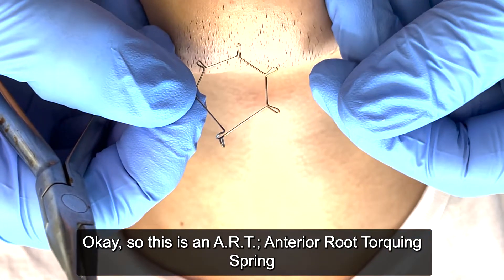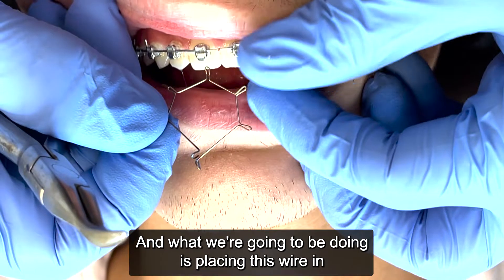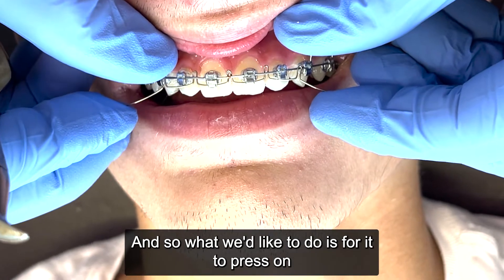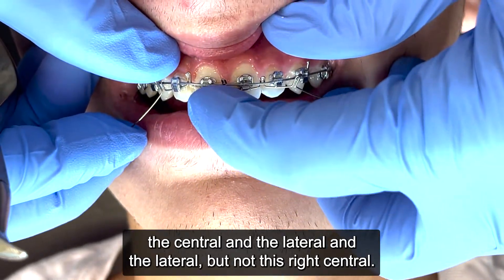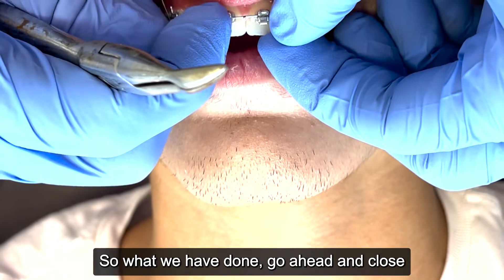This is an ART — anterior root torquing spring — and what we're going to be doing is placing this wire in a W arrangement like this. We'd like it to press on the central and the lateral and the lateral, but not this right central.